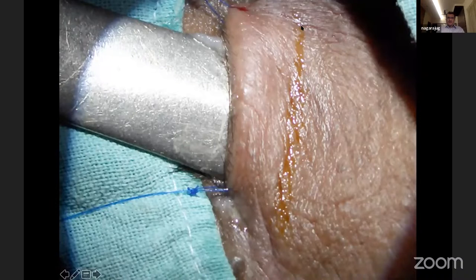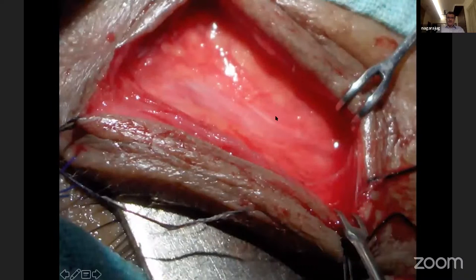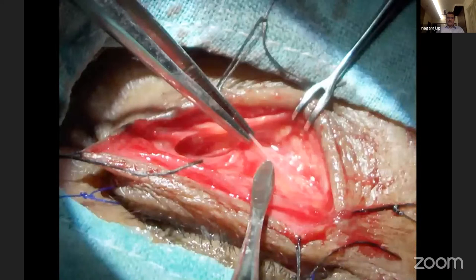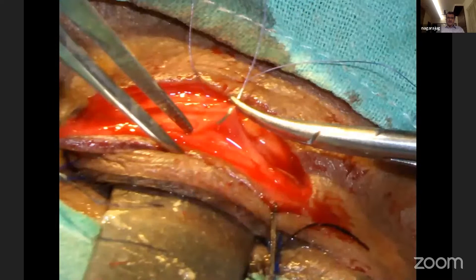You can see marking the incision 4 to 5 millimeter on the skin. We didn't have any radio frequency cautery at that time. Then retract your orbicularis oculi muscle. You see the orbital septum. Then you can identify the retractors. You can see that white line there. These are your inferior retractors. And if there is excess skin, you can try to excise the excess skin there.